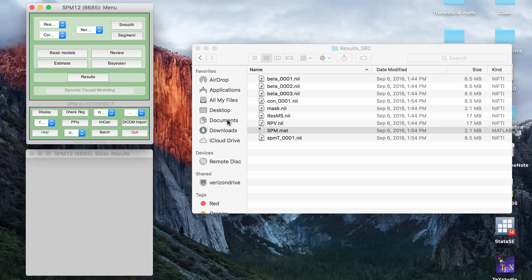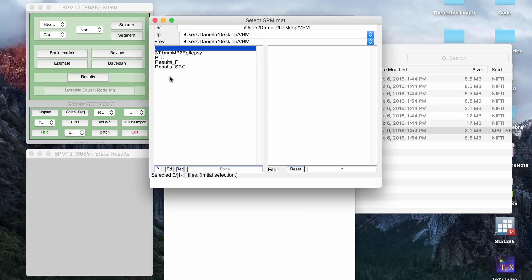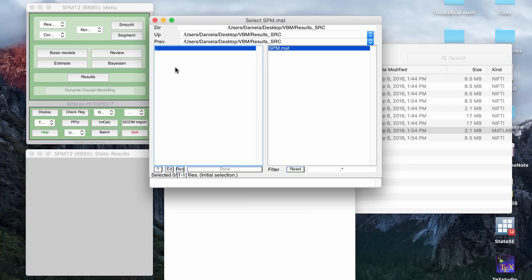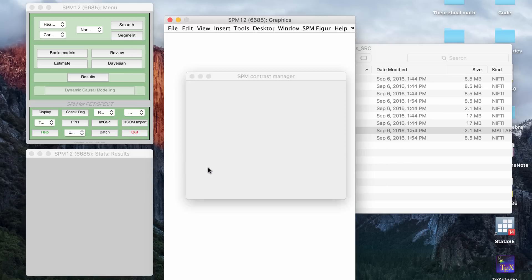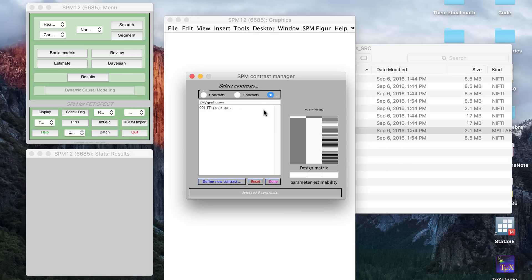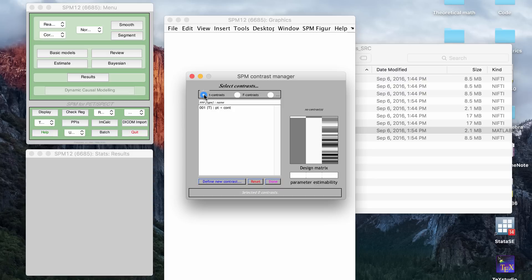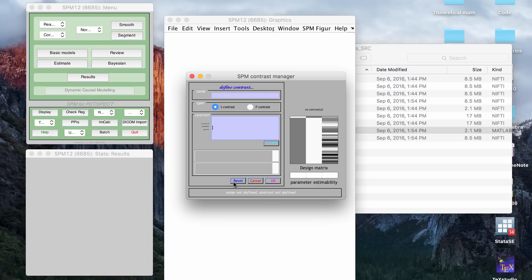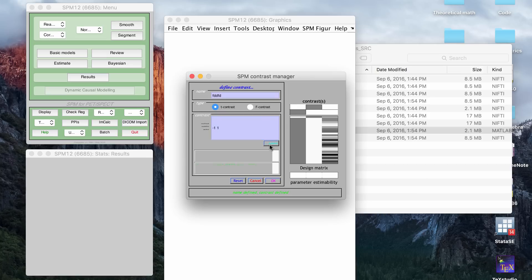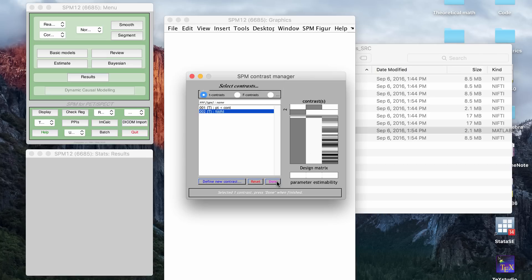Once that's done running, you have to click results and you have to set your T or F contrasts. So again, it's going to ask you to input your SPM.mat file. Once you do that, this little box will pop up. And again, depending on how you want to do your statistics, you're going to set a T or F contrasts. I always put whatever here. For me, I usually do negative one and one. And you click submit and you click OK.